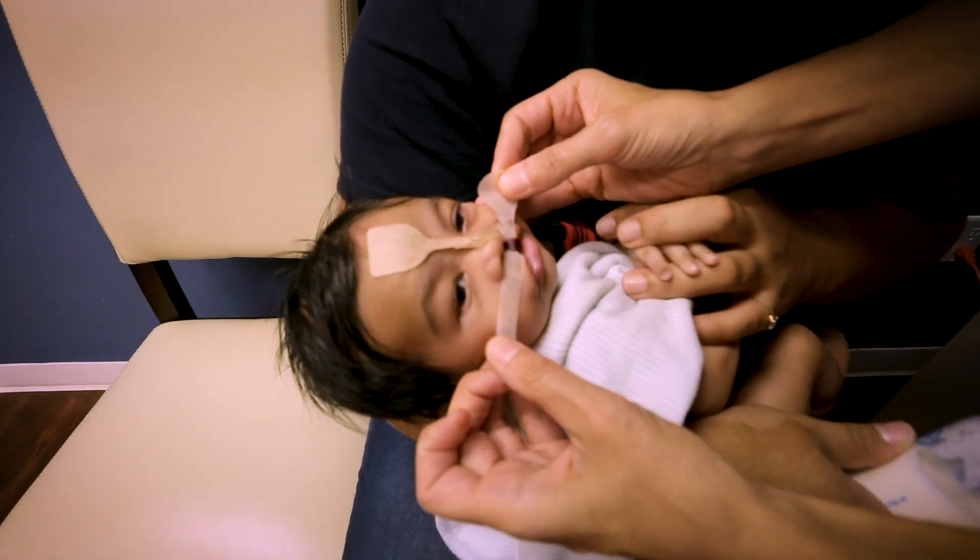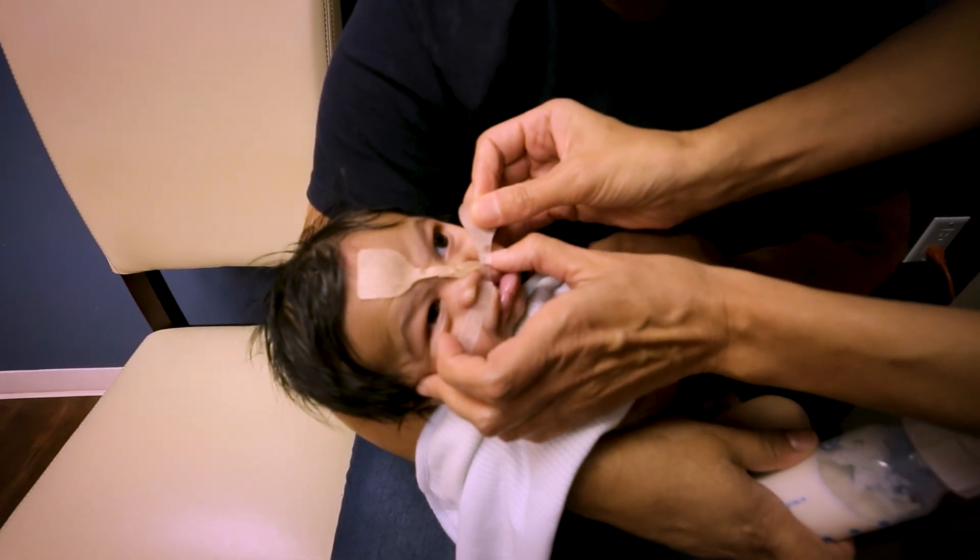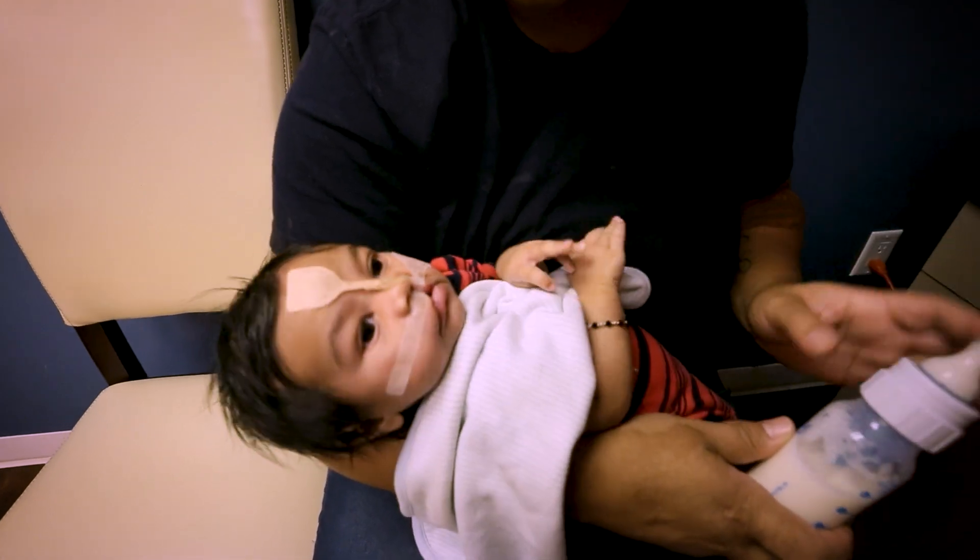On the non-cleft side for unilateral clefts first, gently pull to activate the elastic across the cleft, and then apply to the other side, pulling the cheeks together. Make sure you keep the tape as high as possible so it fits right under the nose. If it's too low, the tongue will tend to moisten it and push it right off.